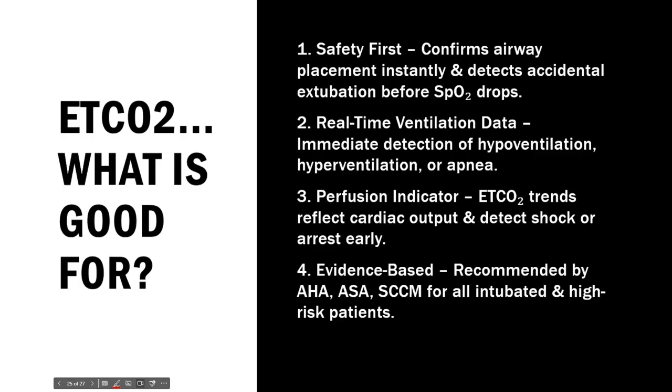So CO2 is showing us, hey, our body is producing energy as it's supposed to. So end-tidal CO2 in itself is a perfusion indicator because it's telling us that we're having blood get to those organs and those organs are able to use it and convert it into energy.